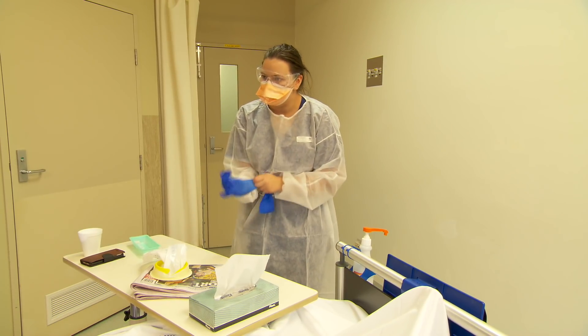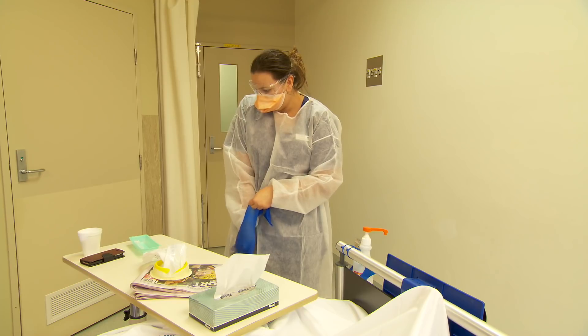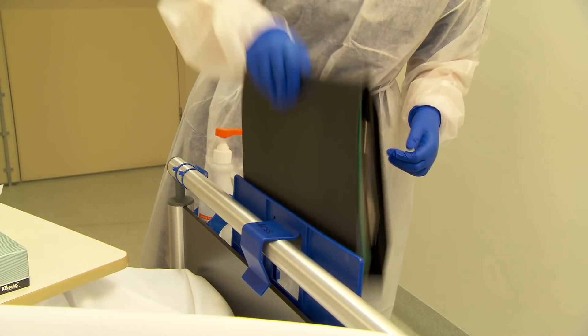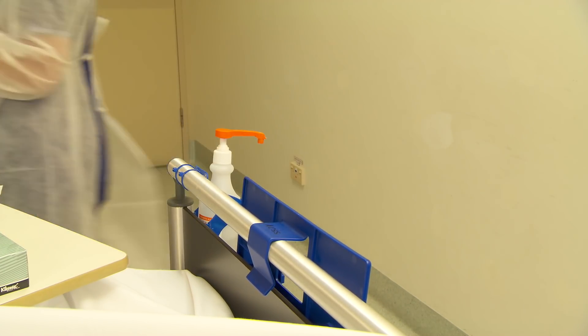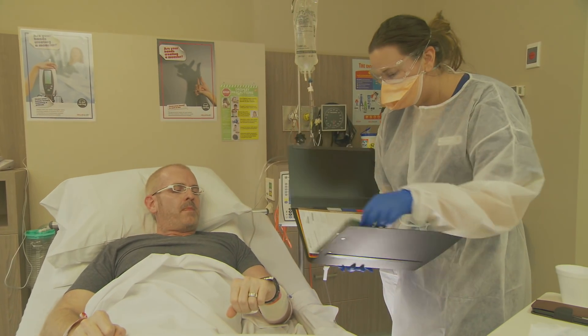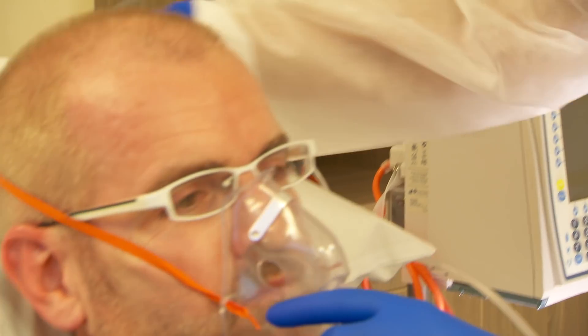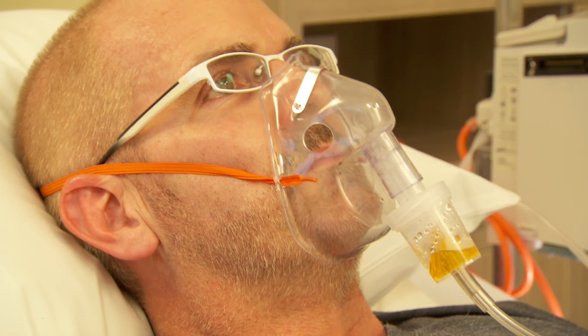Non-sterile gloves are applied, ensuring that the cuffs of the gown are tucked in under the gloves to ensure that there is no skin exposed. Now you can have contact with the patient and their environment. After confirming the patient's identity and administering the nebuliser, instruct the patient to take some nice big slow breaths. This will last approximately five to ten minutes.